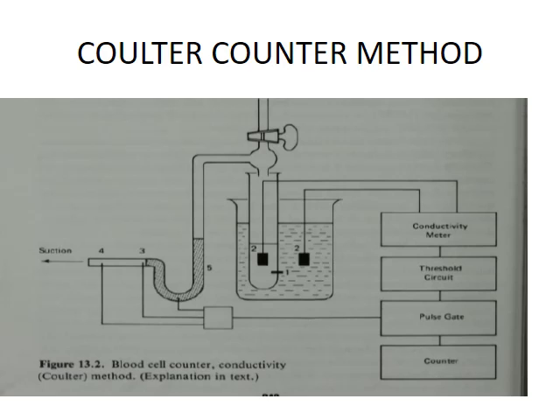The conductance between the solution in the glass tube and the solution in the beaker is measured with the two electrodes, which are marked as 2. This conductance is mainly determined by the diameter of the orifice, in which the current density reaches its maximum. The glass tube is connected to a suction pump through a U-tube filled with mercury, shown as 5. The negative pressure generated by the pump causes a flow of the solution from the beaker through the orifice into the glass tube.